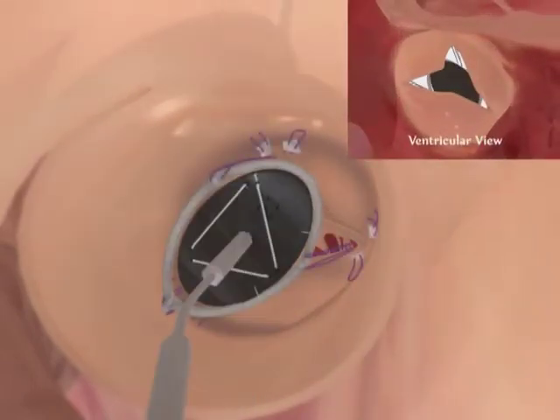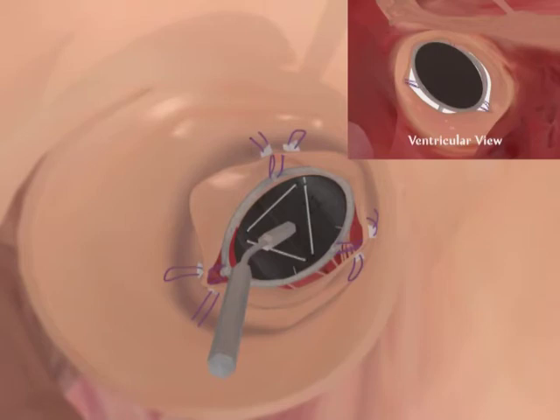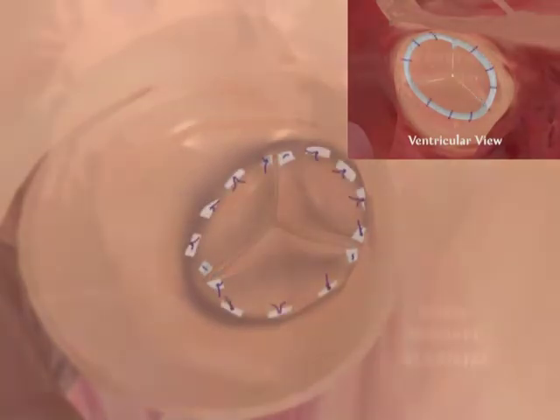The HAART 300 device, mounted on a holder, is placed through and below the aortic valve leaflets, with each device post being placed underneath each aortic valve commissure behind the leaflet attachment junctures with the aortic wall. After placement of the 3 post sutures, the holder is removed from the frame. Additional sutures are placed behind and through the annulus at the base of each leaflet. These sutures are looped around the base of the ring and brought back out behind the leaflet, where each suture is tied off using polyester pledgets to secure the ring in place.